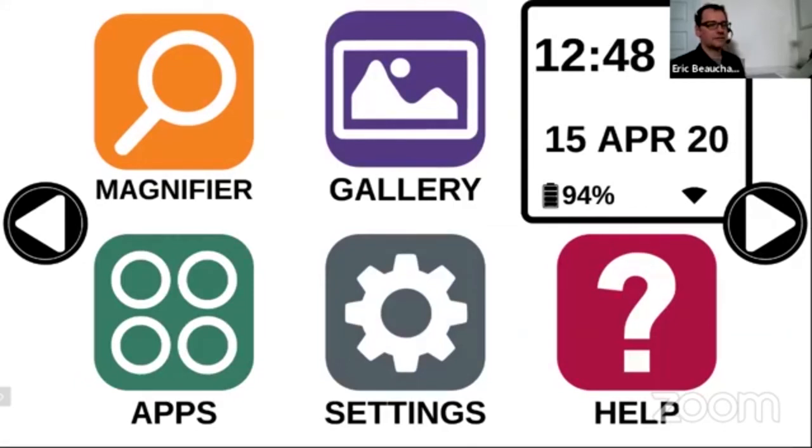And again, just to add to this tile interface, this was done so that the student feels that he has a mainstream tablet. It's just the same way as it's represented in Android, but with a bit bigger icons, but smaller than the carousel. So he's not different from what the other students are using in class. So social acceptance. So that's why it was added, and it's nice to have also a lot more applications on the screen.